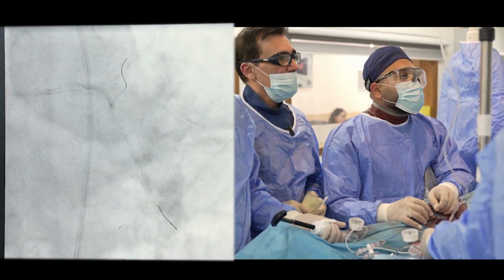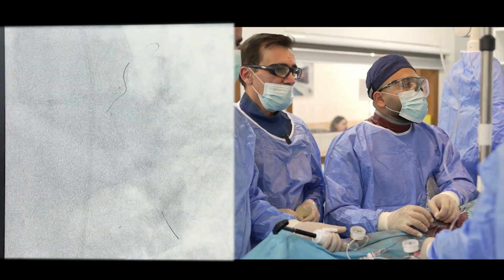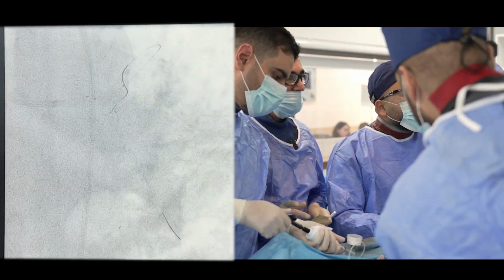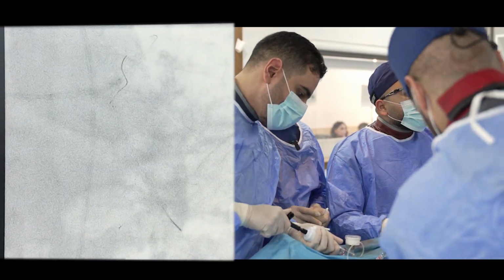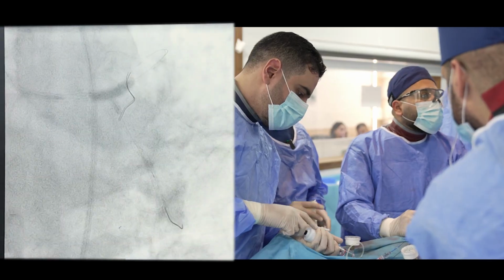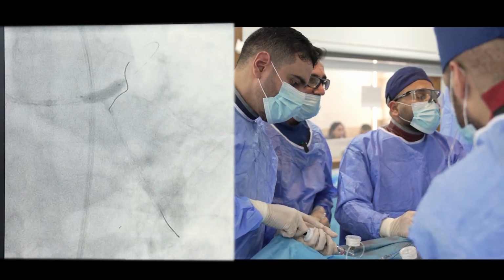Yeah, fluoro. Okay, let's go for kissing. Both for 10. 10. You are 10? Yes. Off.